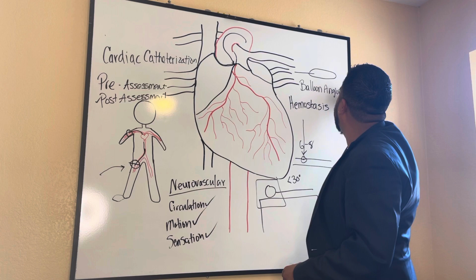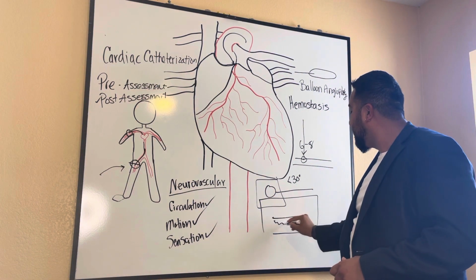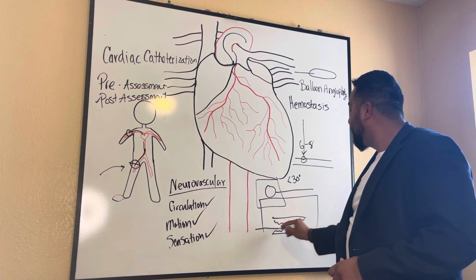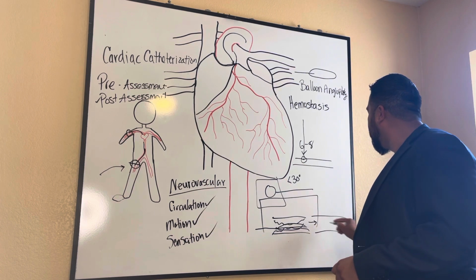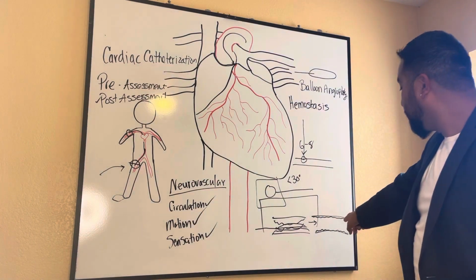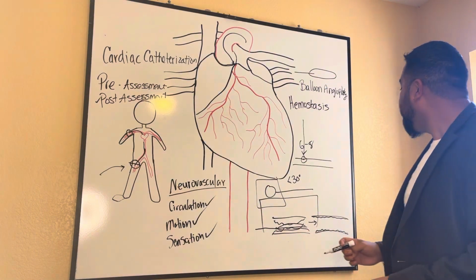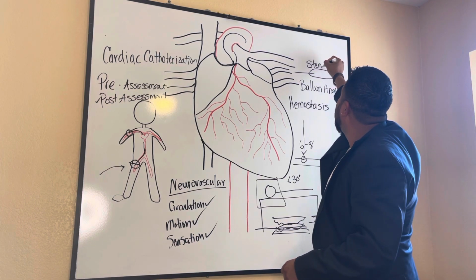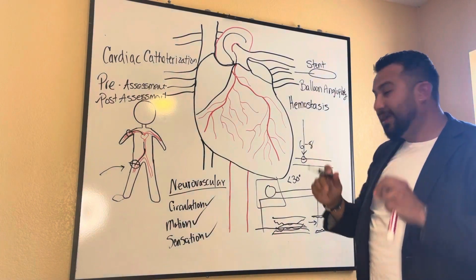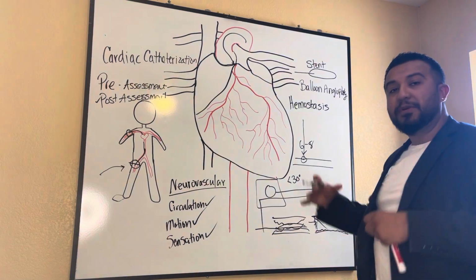angioplasty, meaning where we fix the atherosclerosis, where the blood vessel might have some plaque buildup in there. The balloon goes inside, the balloon then is inflated, and it converts that occluded atherosclerosed blood vessel into a more patent blood vessel where perfusion is much readily able to pass on through, right? The balloon angioplasty may also have the stent, a little device that goes around the balloon, stent placement, which will keep the lumen of the blood vessel open to prevent it from occluding again.